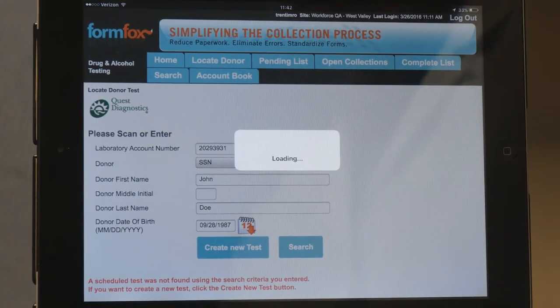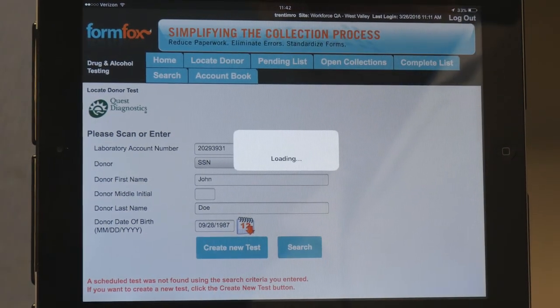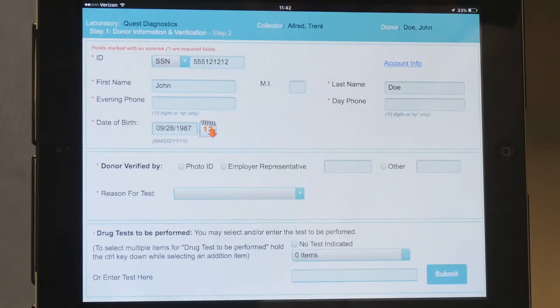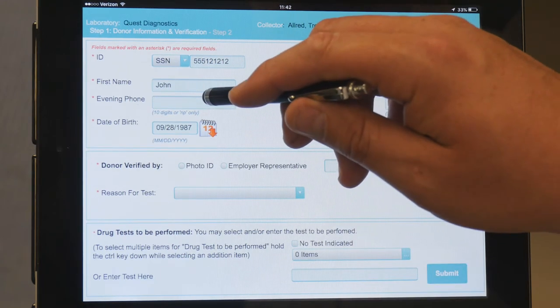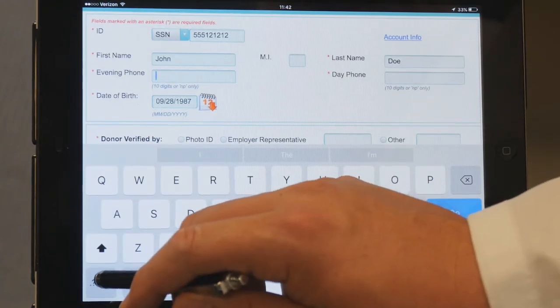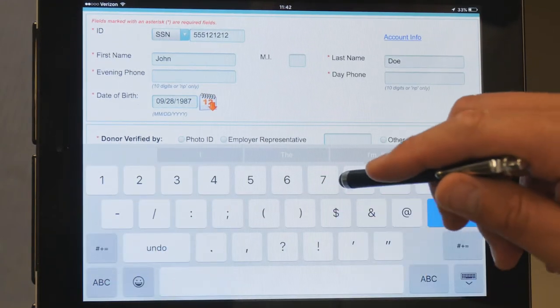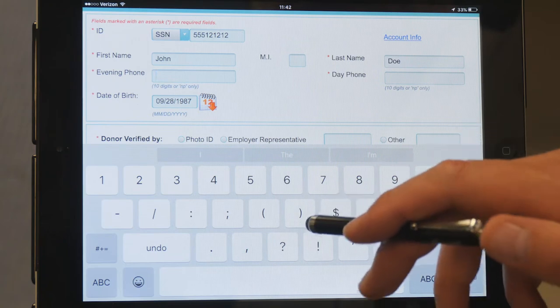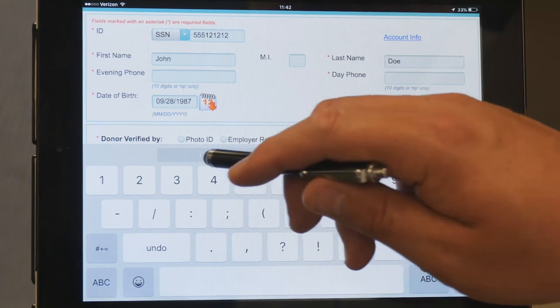On the next screen, verify the donor information, filling out all of the required fields. If the donor cannot provide a phone number for either the evening phone number or daytime phone, enter NP.